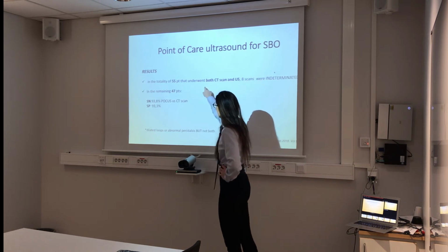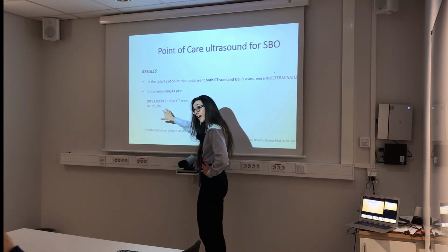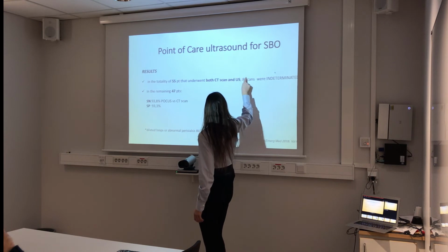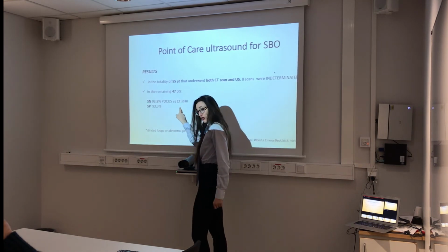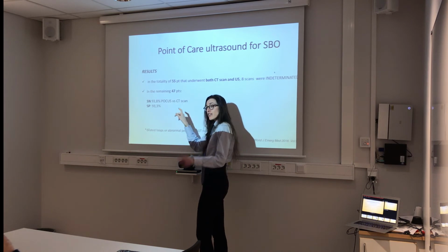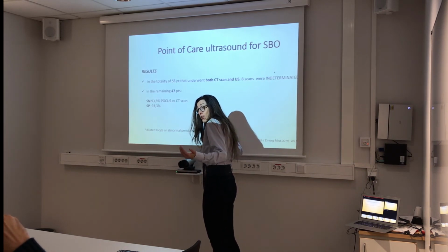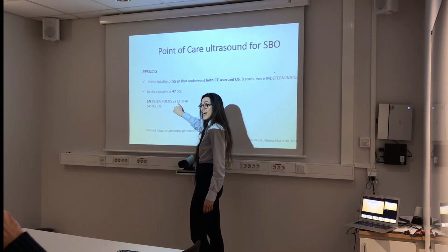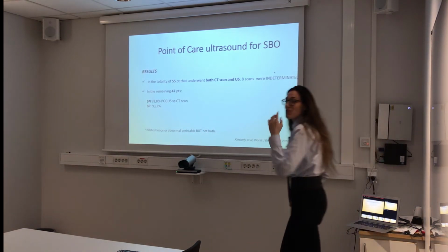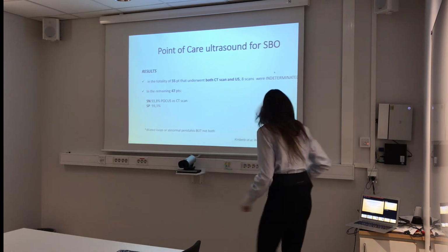Otherwise, if you put those in the gray area, that will screw up your results, because you are not sure whether they were really what you want to see, or whether the CT scan was positive or not. We don't know if these people did have a positive CT scan. This is one of the limitations of the study as well. If those undetermined scans looked like no SBO, and by the end of the day were SBO, the sensitivity drops, probably down to 89%. This is a very good point.